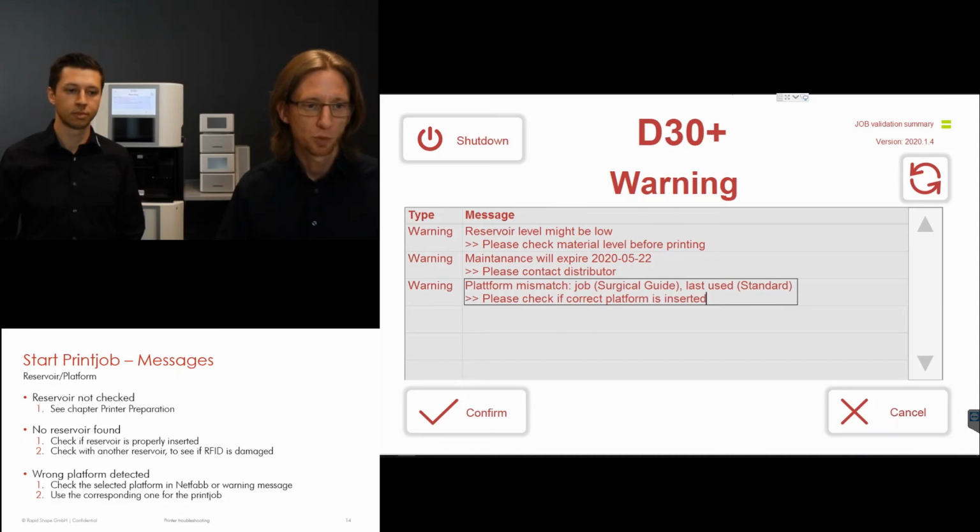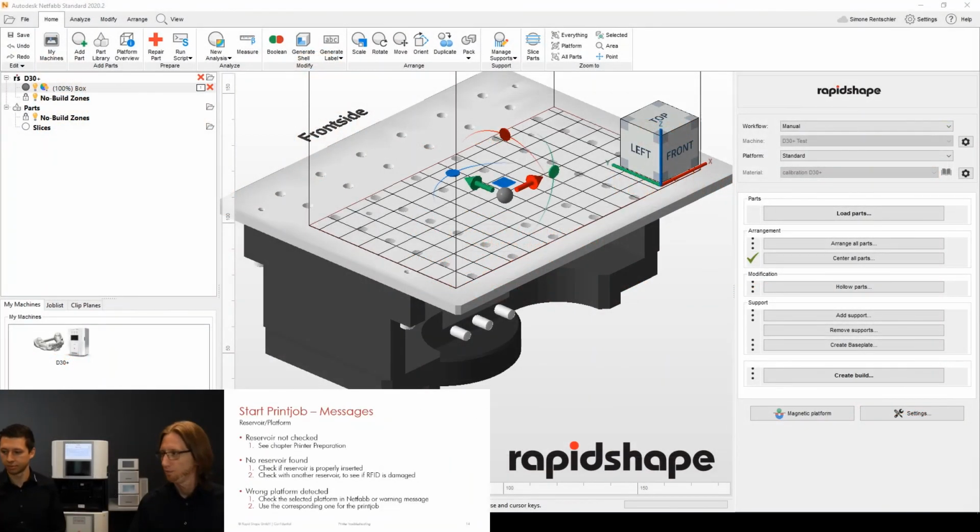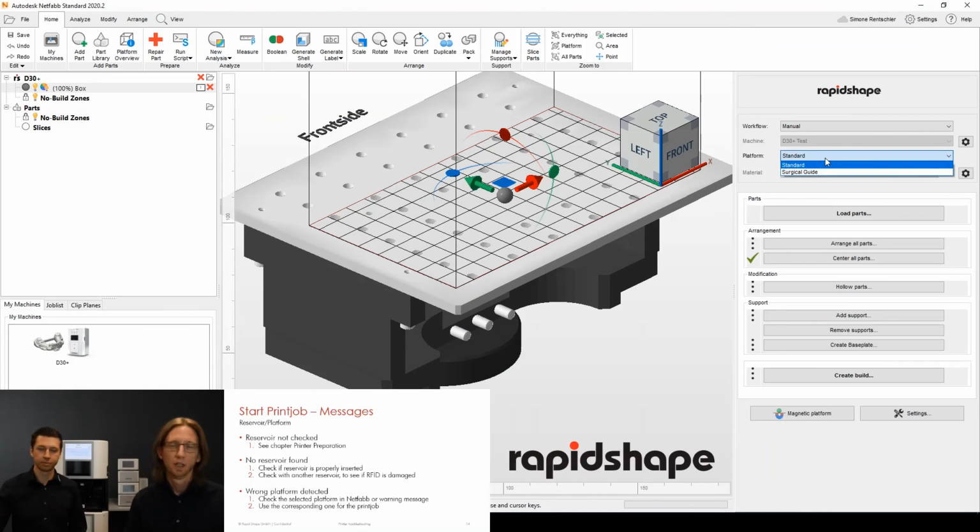Let me show it to you real quick. We got it right here. All right. As you can see, in the settings we have the drop-down menu for the platform. Here you can toggle between standard platform and surgical guide platform. As soon as you make a change here, you slice the job and transfer it to the machine, which will detect if this is the same platform you used in the previous job. It will compare. If this is not matching, it will give you a reminder that the previous job was done with a different platform, just to remind you to insert the correct platform, because that could also be a problem.